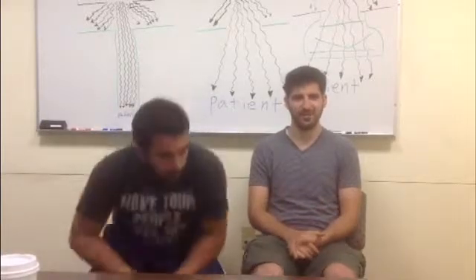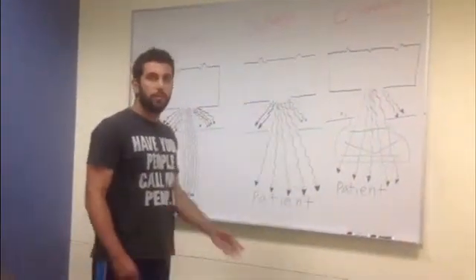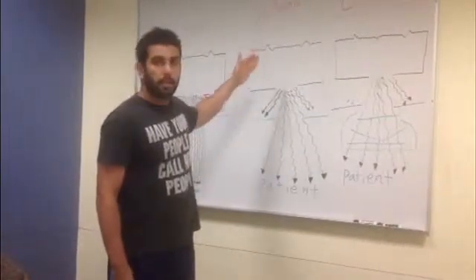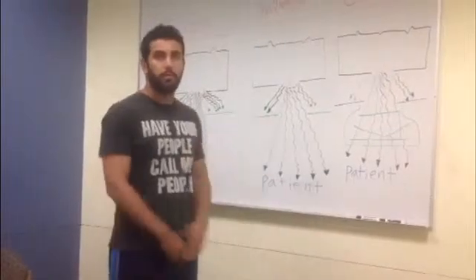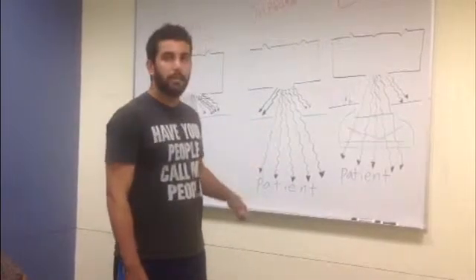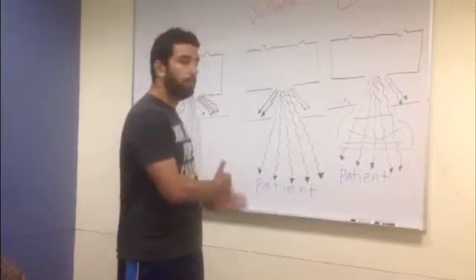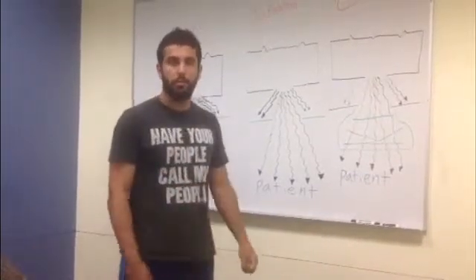As I mentioned to you earlier, there are currently 3 devices in use to restrict X-ray beams. First, we are going to talk about the aperture diaphragm, which is the most basic and oldest form of beam restricting devices. The aperture diaphragm is basically made out of lead and lead-lined metal placed in the tube to restrict the beams emitted from the tube.